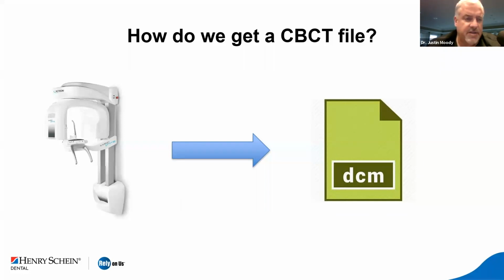Not to mention that this machine is one of the few things in my career that has come down in price over the years. I bought the first ConeBeam CT to be used in private practice in the state of Nebraska back in 2006. It doesn't seem like 14 years ago was that long ago, but I think that I paid over $220,000 for what at the time was an iCat Classic.